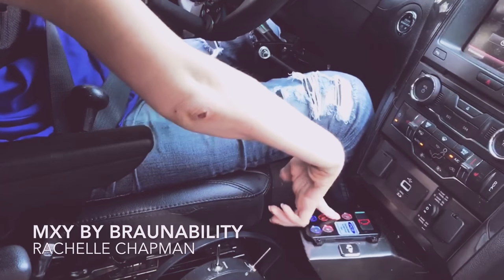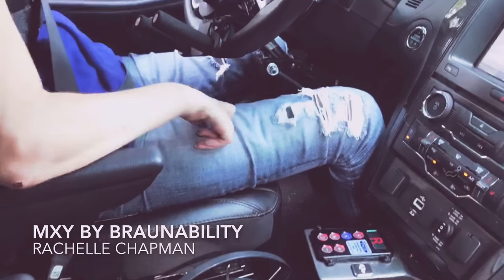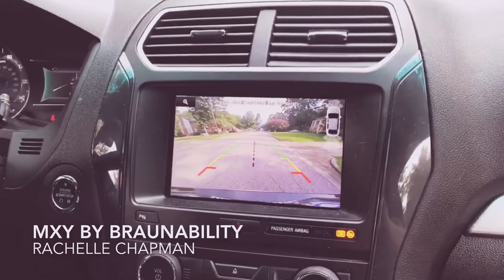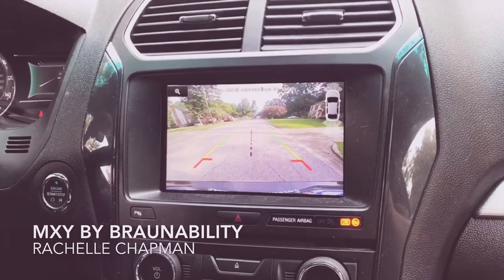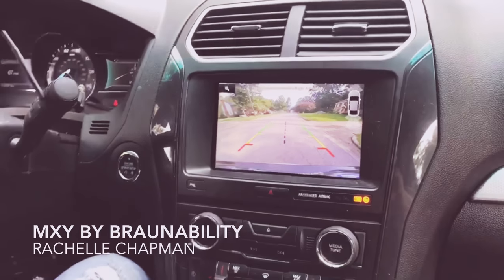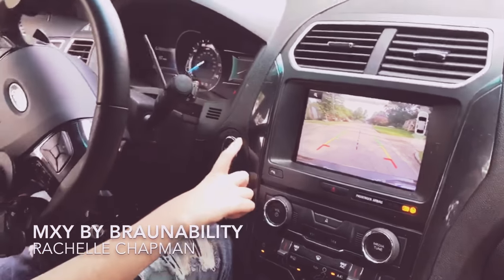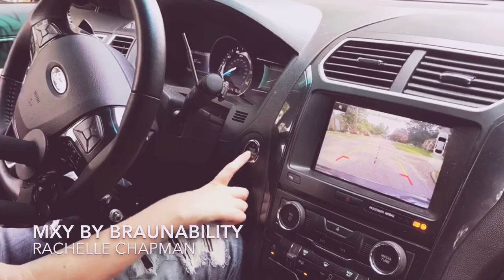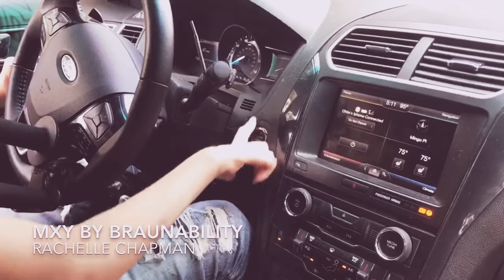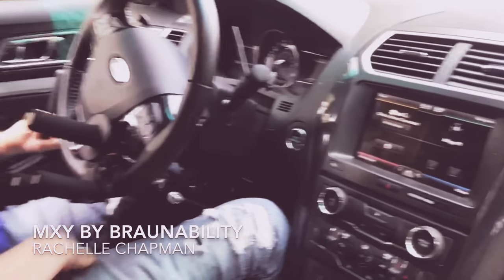So this is how I shift. I'm going to put it in reverse. And there's your backup camera. Yeah, I love that thing — it makes it super easy to back up and maneuver and everything. And then I'm going to turn the car off. I don't need a key, I just have to press this button right here. Put it in park. And there we go.